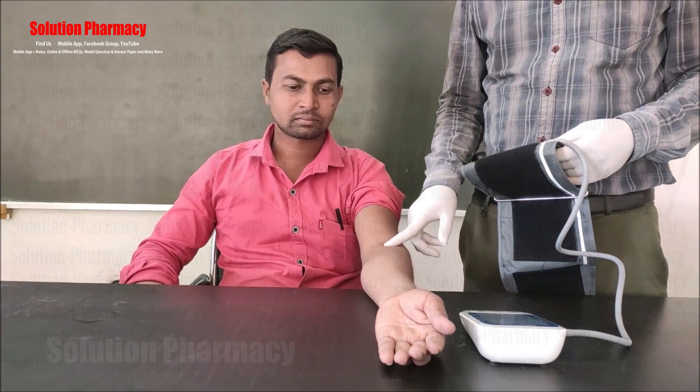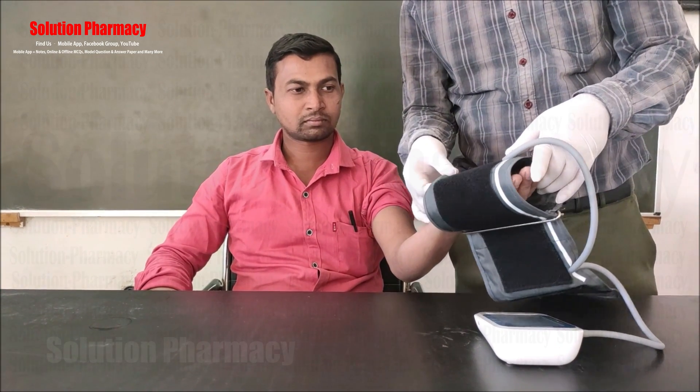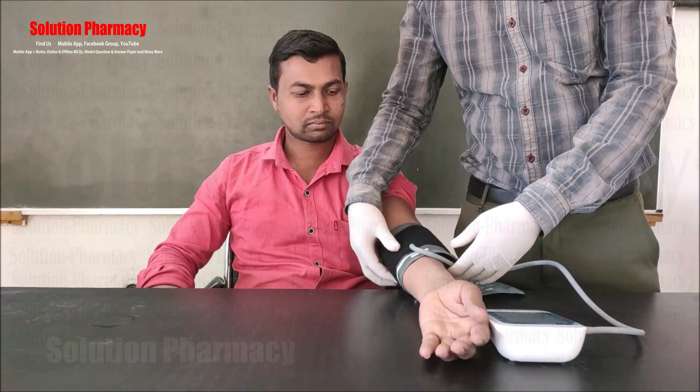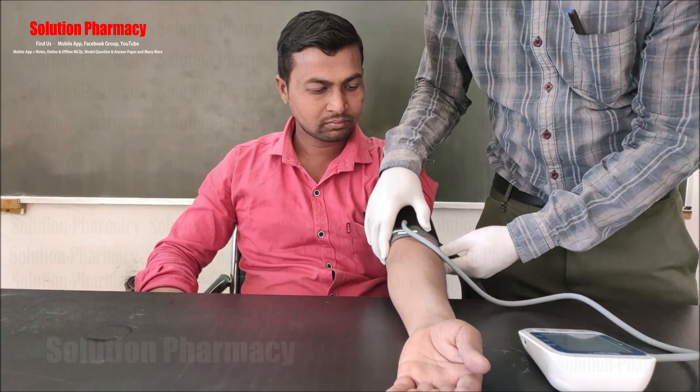Before measuring blood pressure, ask the person to sit down for at least 10 minutes. The hand should be in a relaxed position with the palm facing up. Then slide and place the cuff onto the arm, with the air tubes and artery mark region oriented towards the lower arm.